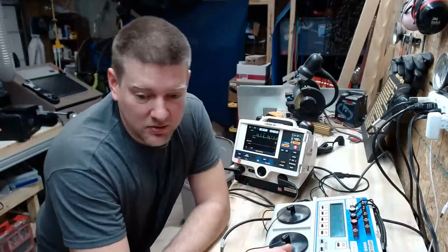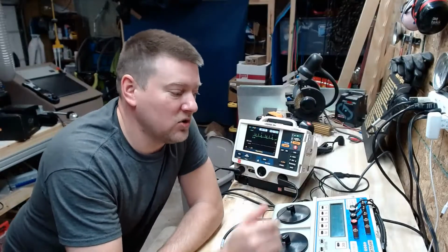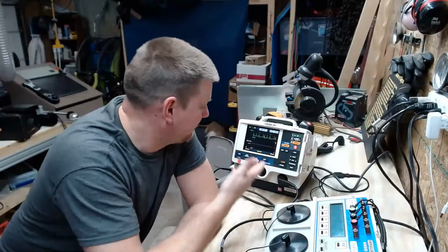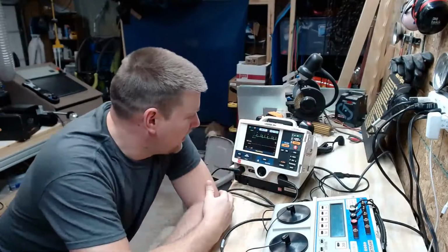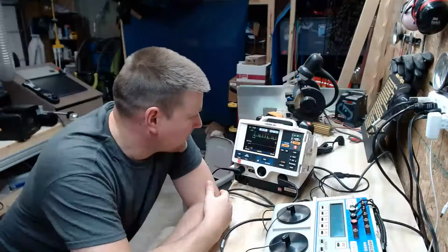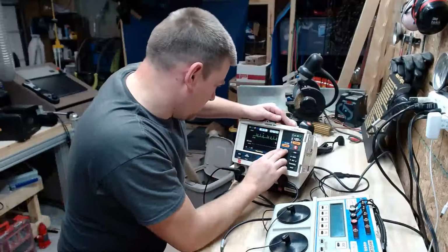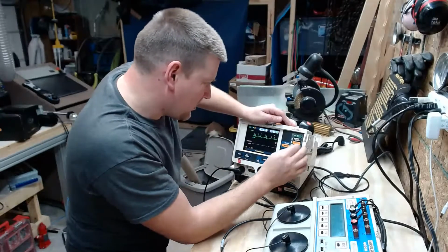So that is one of the most important things that we document. You're going to document that you set it at demand mode, you tested below and above at this heart rate and this heart rate, and that you verified that you have your pulses. Let's see if this still works. I'm going to shut off pacer mode.